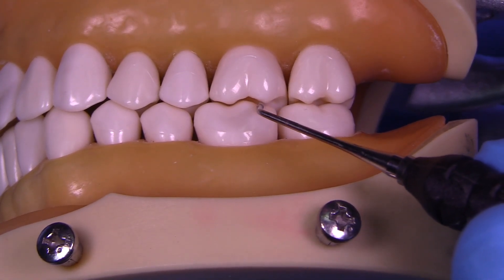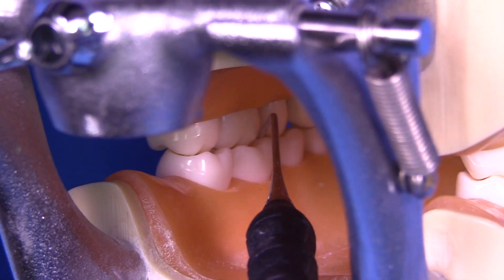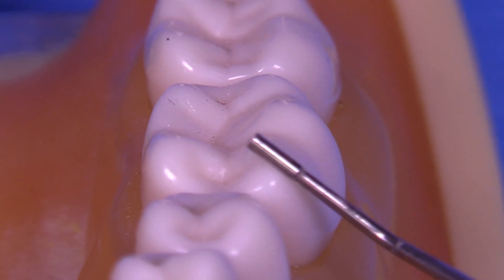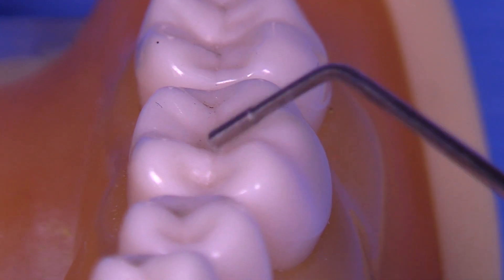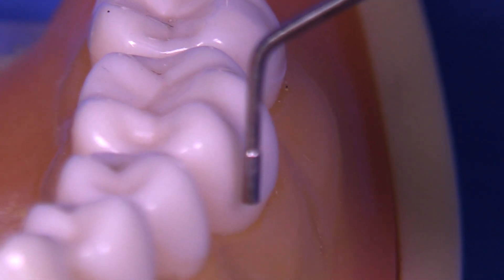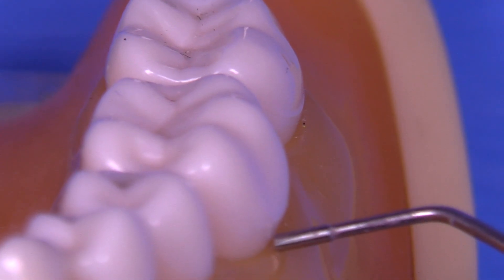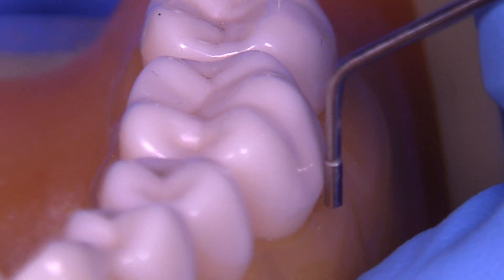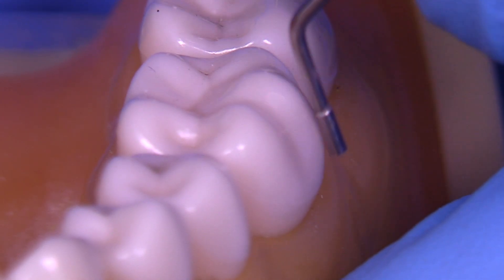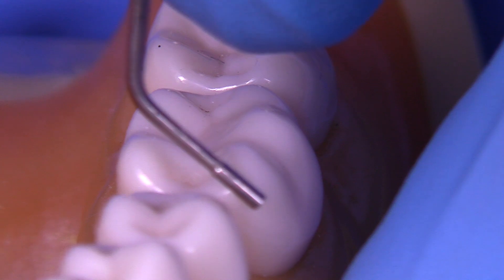Notice how there's a little bit of space in the normal typodont equilibration. On the lingual it's pretty socked in, but on the facial there is some opening, so when you're finished you're going to see some space there. Remember, this is the A, B, and C planes. When we reduce the occlusal, we're going to want to pay attention to that. Also notice this bulge on the facial is pretty huge, and if you're not aware of this bulge you may end up creating an undercut on the facial. We need to remove the majority of that bulge and respect the secondary plane that needs to follow differently than the functional cusp bevel.